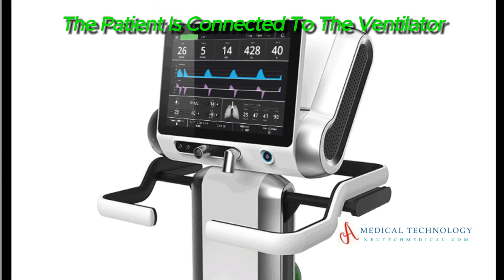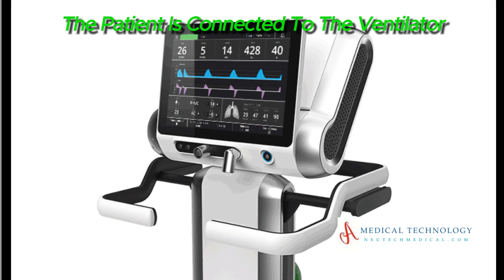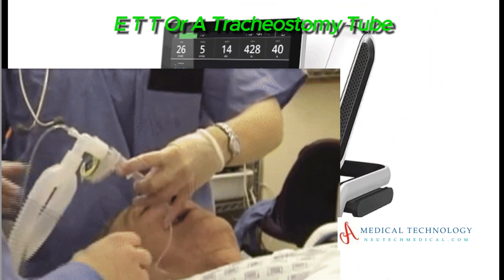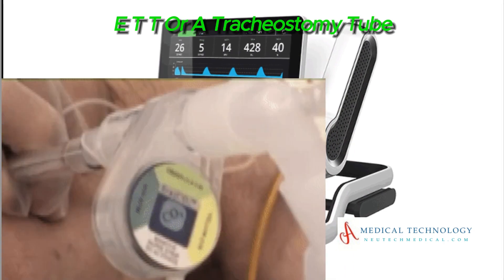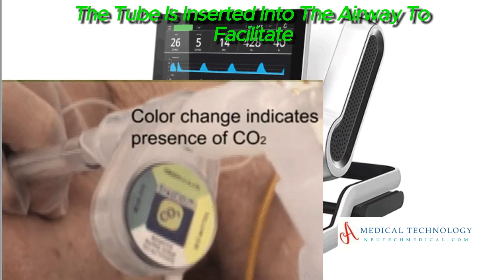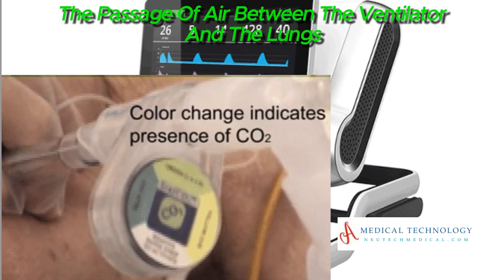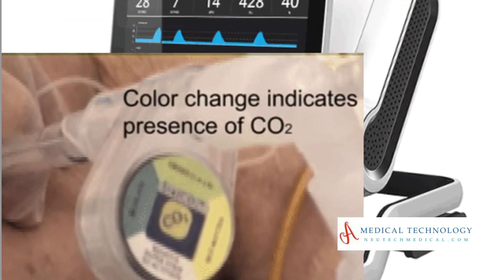The patient is connected to the ventilator through an endotracheal tube (ETT) or a tracheostomy tube. The tube is inserted into the airway to facilitate the passage of air between the ventilator and the lungs.